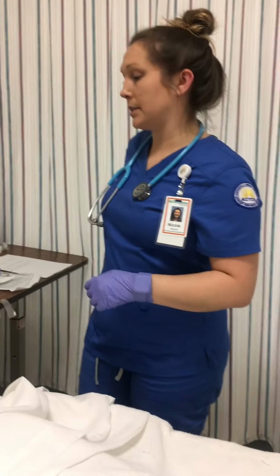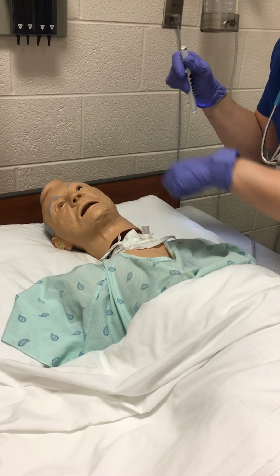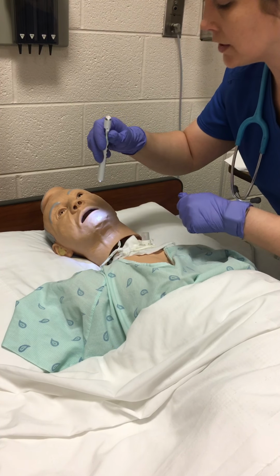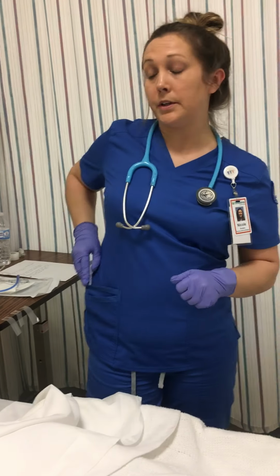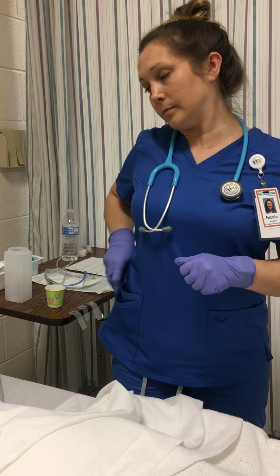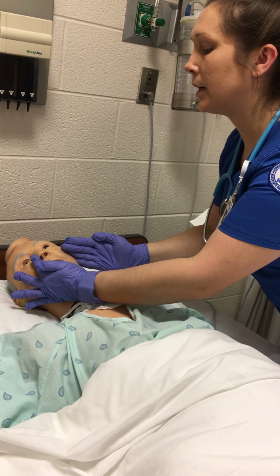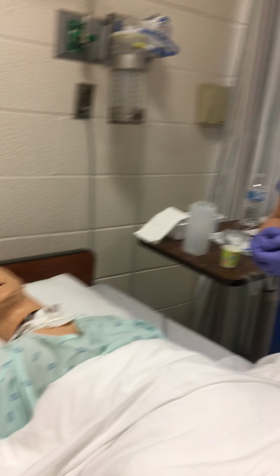and then I'm going to assess his mouth. So ask him to open his mouth and with the tongue blade push his tongue down, see if there's any lesions or sores, and then I'm going to do a naris test to decide which naris I want to use for the NG tube. I'm going to occlude one naris, have him sniff, occlude the other one, have him sniff, and then from there we'll decide which naris to use.